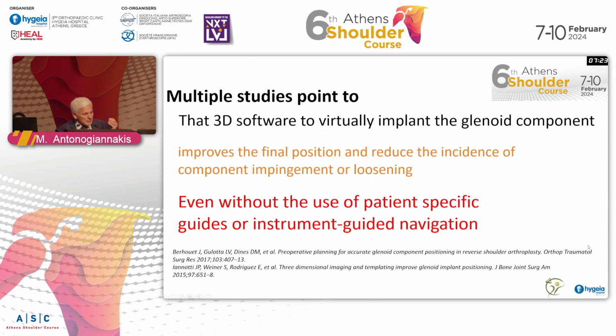So, what Bruno said before: start preoperative planning. Even if it's not perfect, even if it has a lot of problems, even if it takes time, it is what is going to make you safer, and so more accurate, more consistent, and a better surgeon in the end.